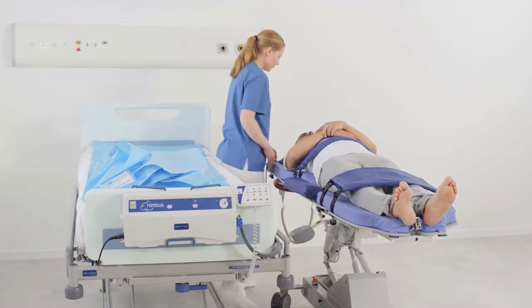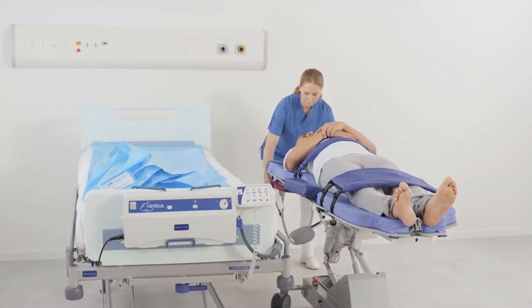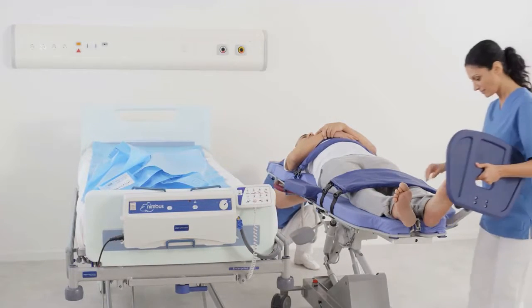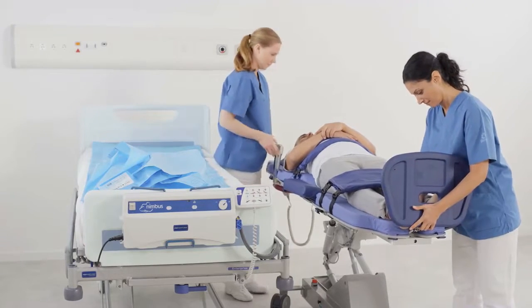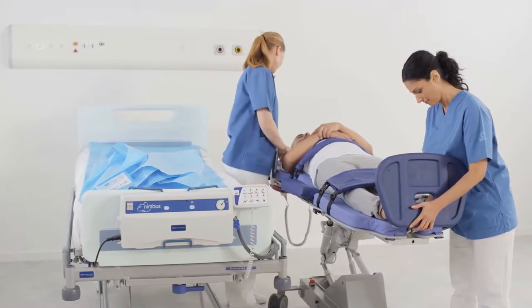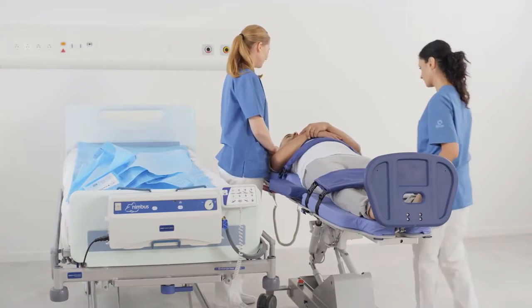Check that the head cushion is comfortably in place and secure the head cushion strap on the back. If used, fasten the head safety strap. Attach the foot support. Raise and lock the shoulder supports. If needed, adjust them sideways.